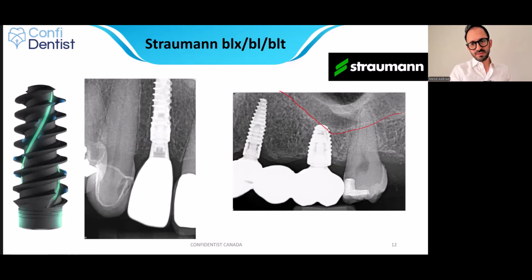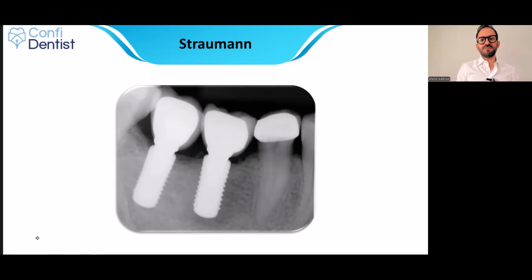Floor of the sinus, okay, some evidence of calculus, composite restoration, some evidence of periodontal bone loss, okay? Zygomatic process of maxilla, other important findings that you guys can detect on this X-ray.